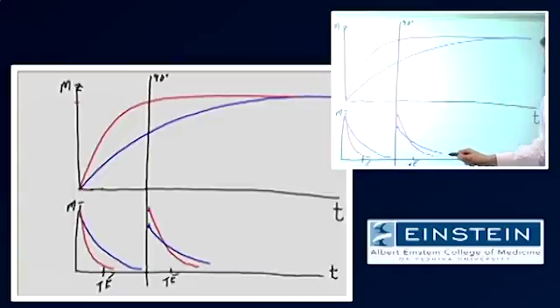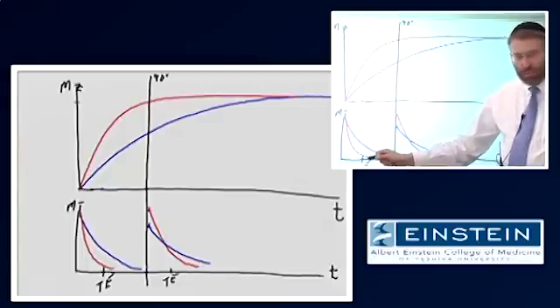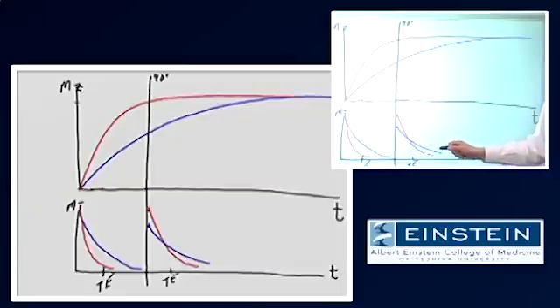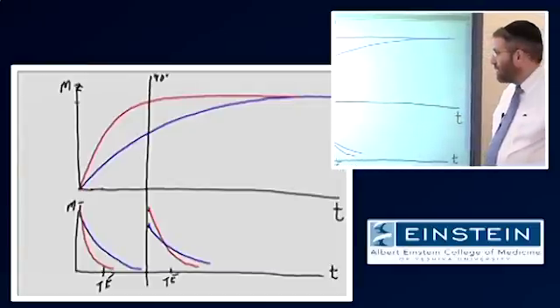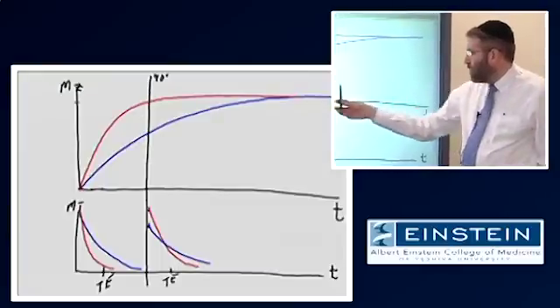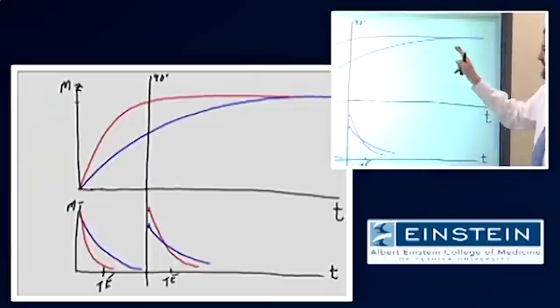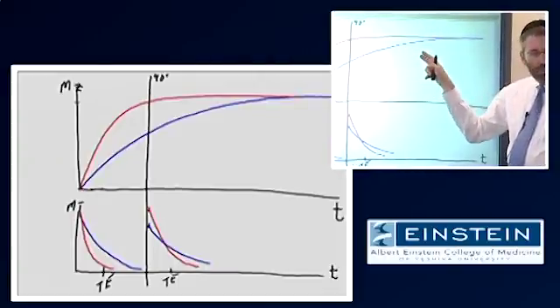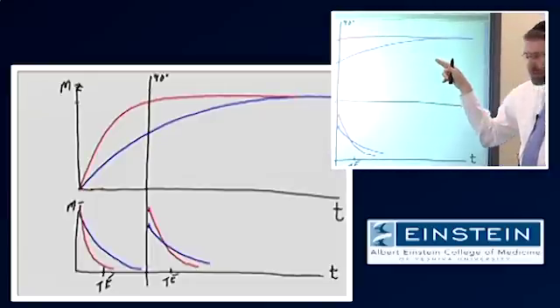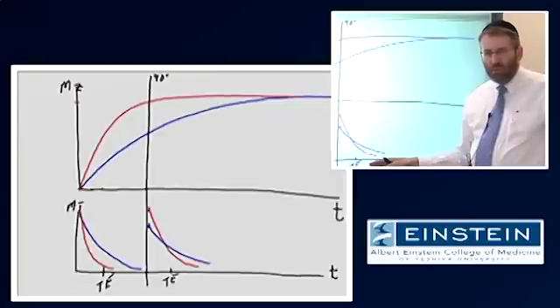So whereas the first time that we sampled this signal, everything was a function of T2, the second time it's a function of T1 and T2. If we would have taken this out much farther, the farther out we go, the smaller this difference, and the less difference due to these T1 relaxation differences would be embedded in the signal that we sample at TE. Any questions about this?